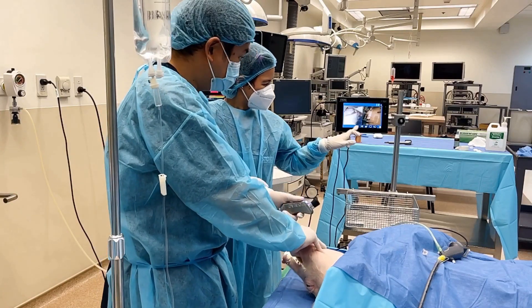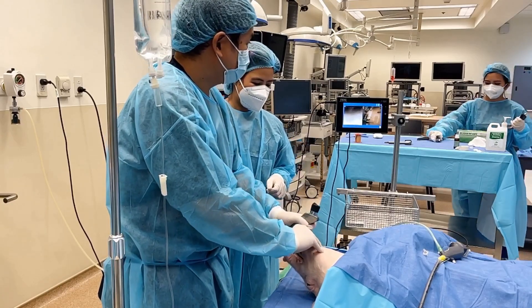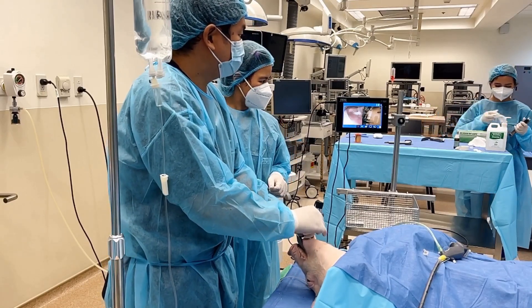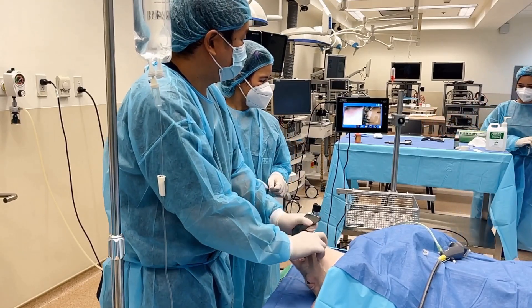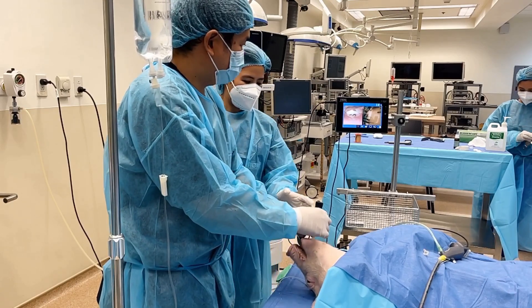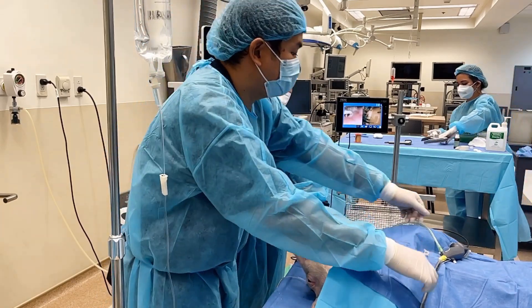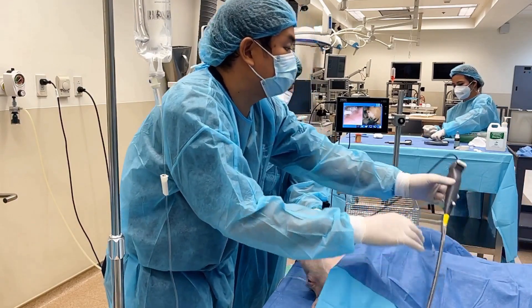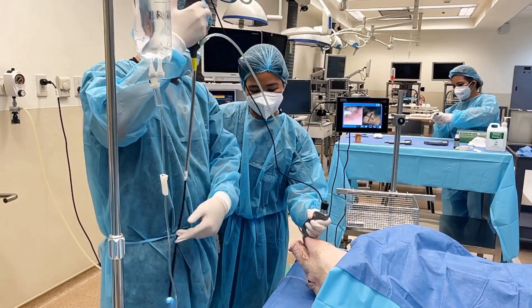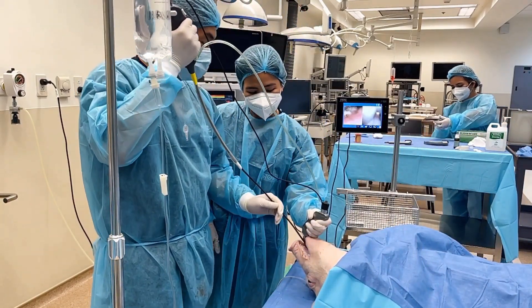Here are the steps in performing the video laryngoscope and flexible scope combo. Perform a video laryngoscopy. Ask the assistant to hold the video laryngoscope exactly as you have positioned it, then insert the flexible scope.